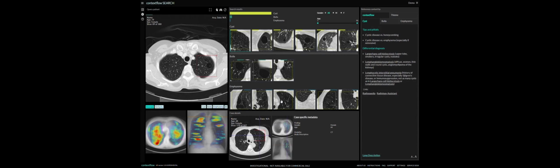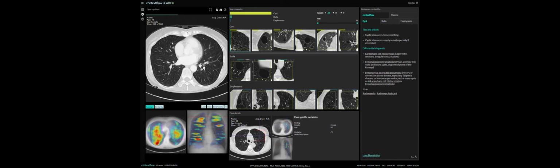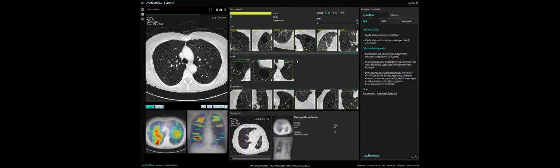What is also possible now is an automated analysis, so that when the radiologist opens the image, immediately the system finds those patterns that are occurring most often and shows them in the bottom left. So even without selecting an area, the radiologist already gets an overview of the anomalous patterns that are occurring in the lungs, and can then also interact with the search engine as before.